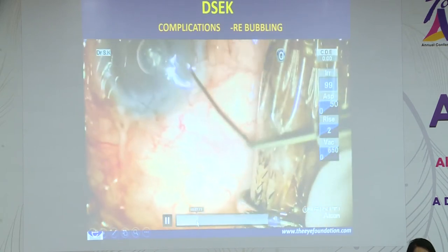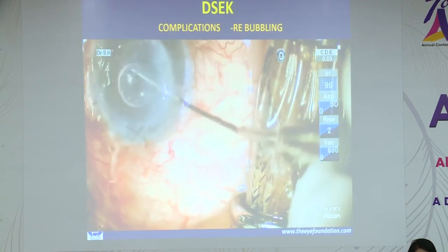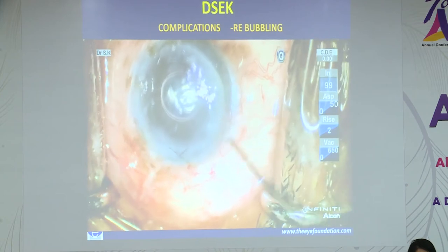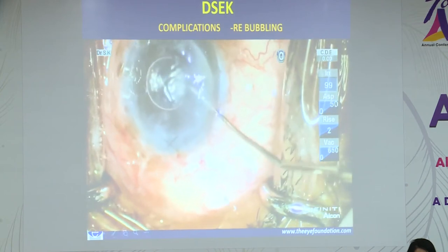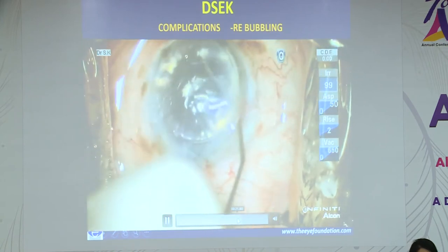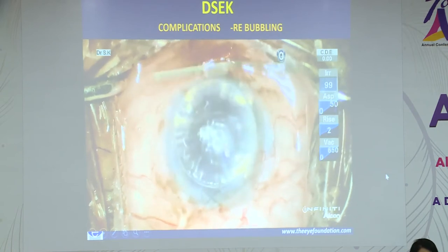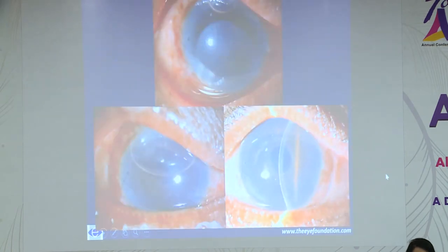You can go to the interface with the help of a Sinskey hook. You can just reposition the lenticule and inject an air bubble into the anterior chamber and tamponade it. This is the post-operative picture of the same patient.